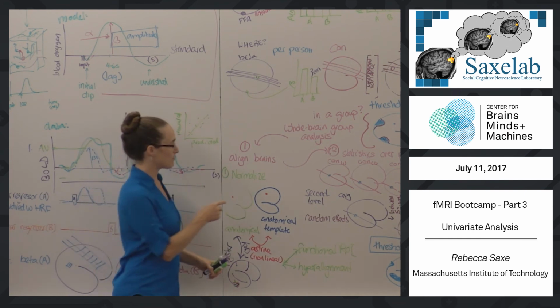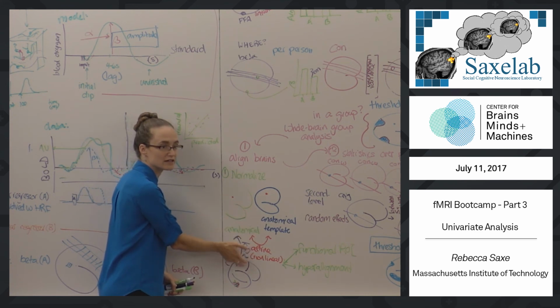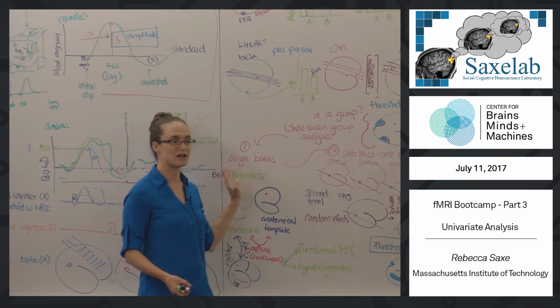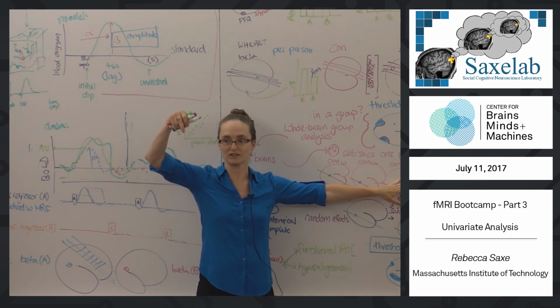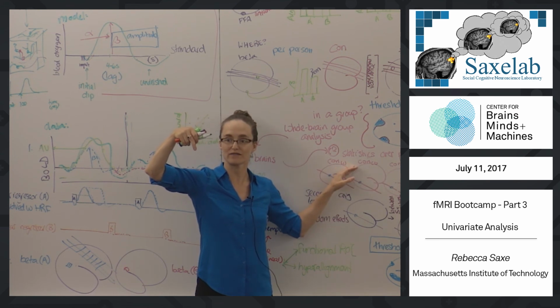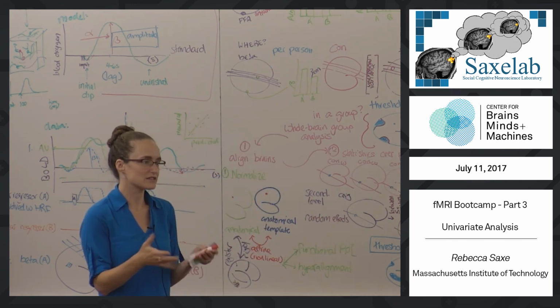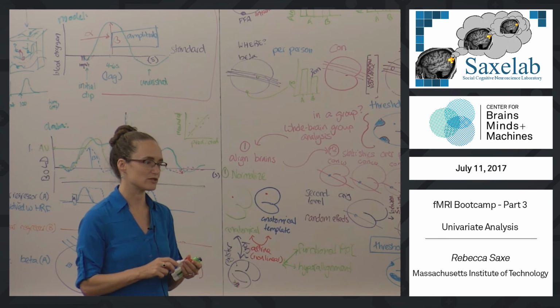Almost everybody, almost all the time, will have done at least normalization and rigid registration of the functional data to their own anatomical. And some people will have tried to do something else to get the registration better. And then once you're done doing that, you go on to these steps where you say, okay, now the data from this voxel, 52, negative 27, 40, that particular voxel, we're going to treat as a measure of the same brain region across all the different subjects and proceed with this analysis. Basically, what you're doing is treating it, instead of at the voxel level, at the region level, which is slightly larger. But an ROI is a way of solving the registration problem.